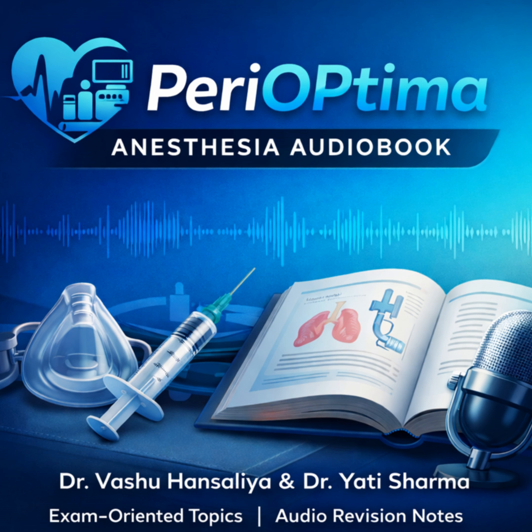Okay, let's talk structure. What are the key components in the flow path from the patient's circuit to final disposal? Conceptually, you've got four parts: the collecting assembly, the transfer tubing, the interface, and the disposal system. And we don't need to know every single screw and pipe. No, but you have to understand the physics. With the transfer tubing, for example, you have to remember that any bends or kinks in that tubing significantly increase the pressure drop per unit flow. Okay, so that's a design factor that could cause problems. A huge problem, yeah. Especially if your disposal system is passive.